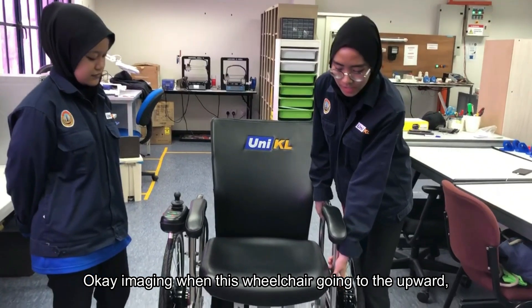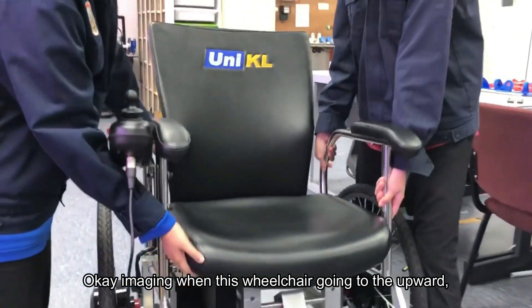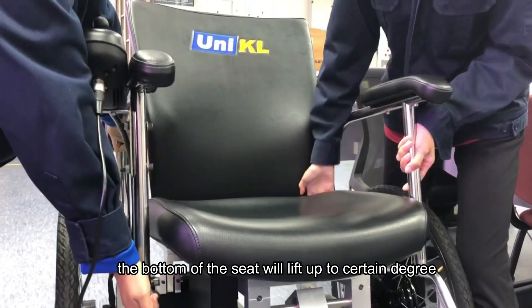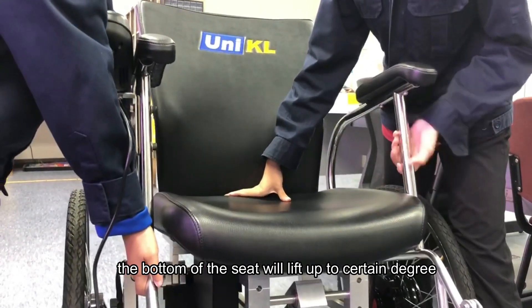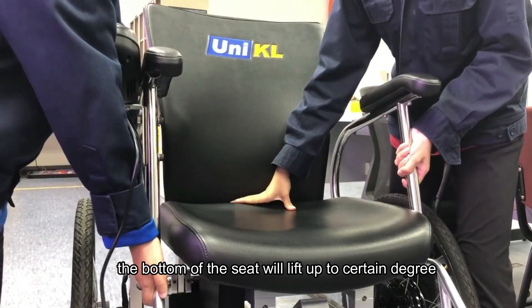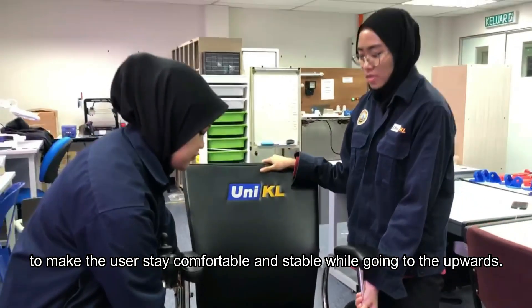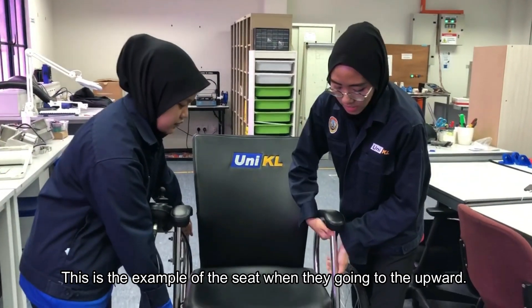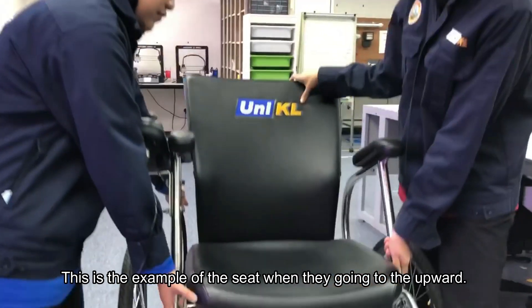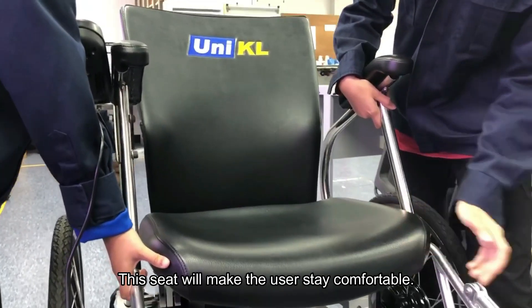Imagine when this wheelchair is going upwards — the bottom of the seat will lift up to a certain degree to keep the user comfortable and stable while going upward. This is the example of how the seat adjusts when going upwards, keeping the user comfortable.